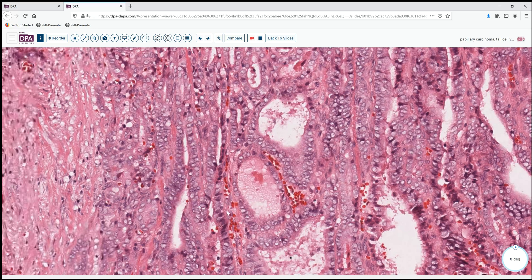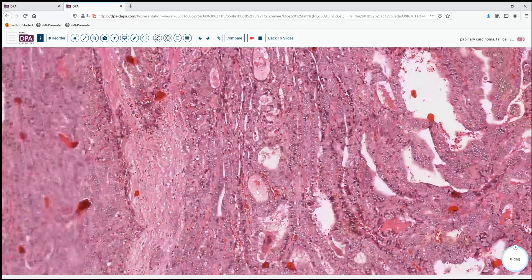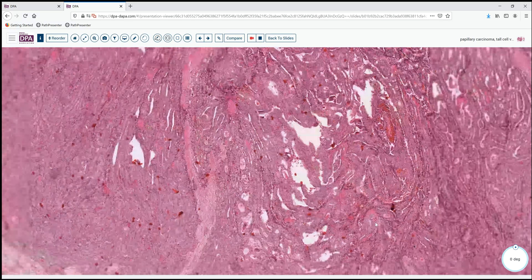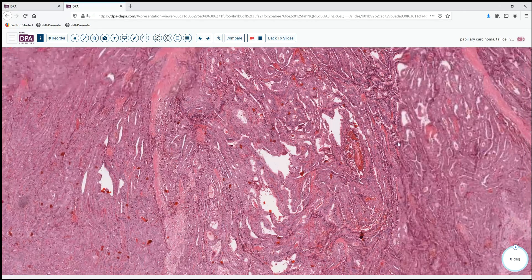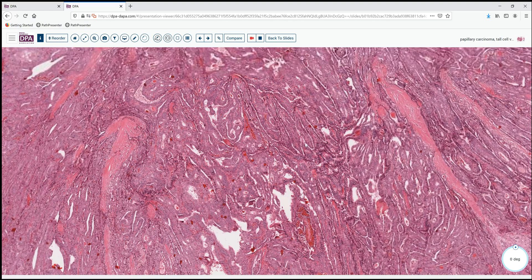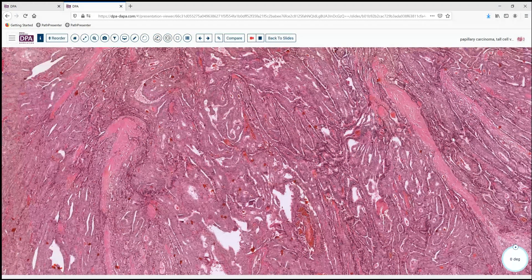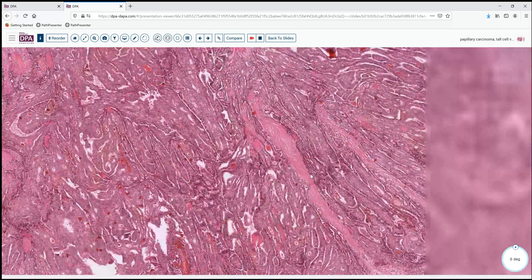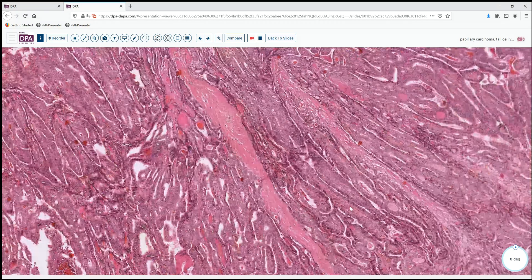So what we don't see, however, are typical papillary structures. We don't see any psammoma bodies per se. We just see these long serpiginous winding channels of fairly elongated structures.